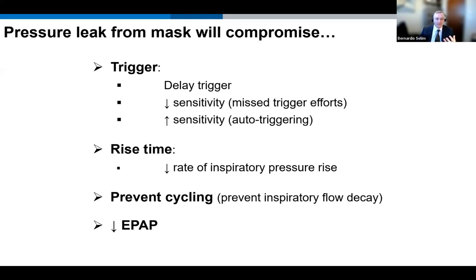Nothing that you think you're delivering based on your settings will be what actually happens, because it is going to be completely changed by the mask leak that is present. So always, always, don't get fancy. Go to the basics. One of the main things that will happen most of the time is that the mask leak will be compromising the delivery of the treatment of your patient.